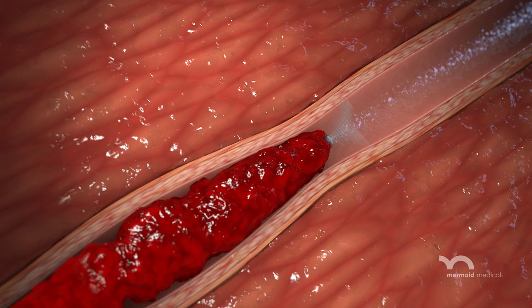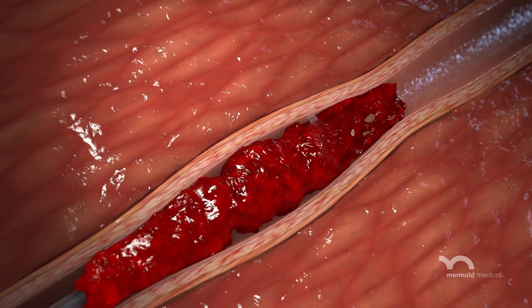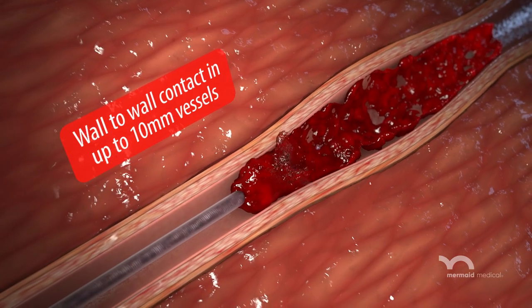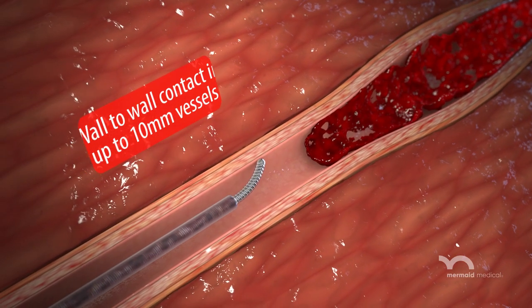When activated, the tip rotates at more than 10,000 RPMs to effectively macerate and aspirate thrombus. It automatically adapts to variations in vessel size up to 10 mm diameters.